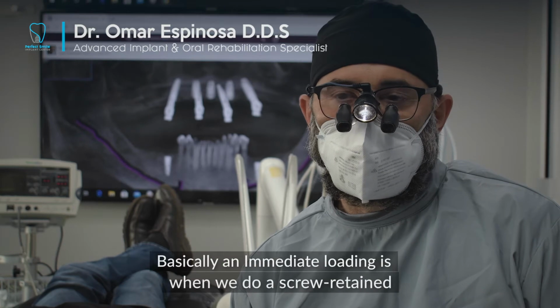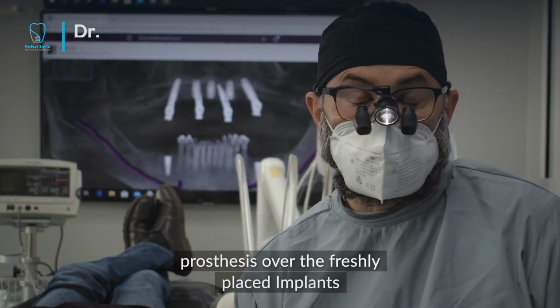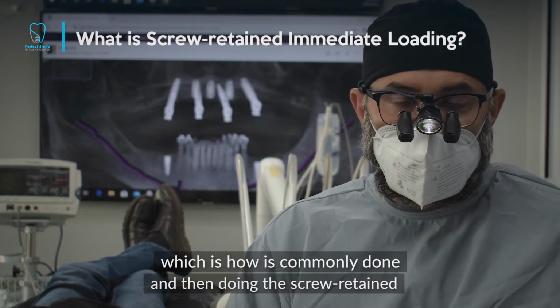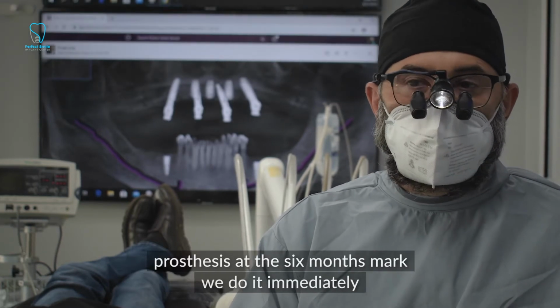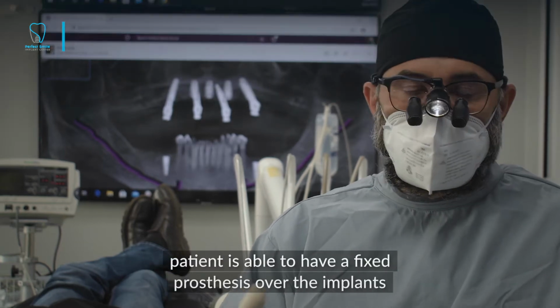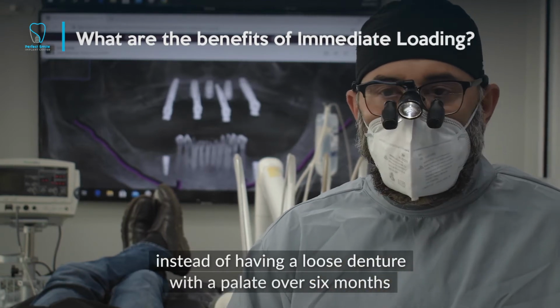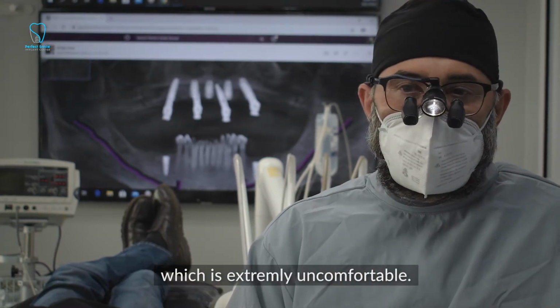Basically, an immediate loading is when we do a screw retained prosthesis over the freshly placed implant. Instead of waiting 4 to 6 months with a traditional denture, which is how it's commonly done, and then doing the screw retained prosthesis at the 6-month mark, we do it immediately. The patient is able to have a fixed prosthesis over his implants instead of having a loose denture with a palate over 6 months, which is extremely uncomfortable.